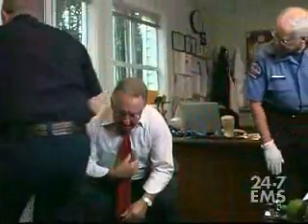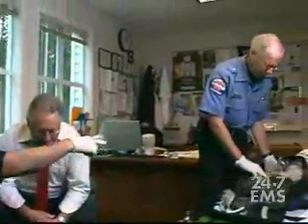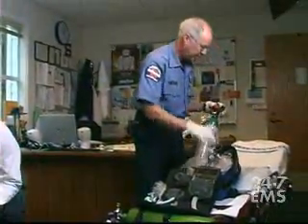Fire department. Hi, sir. What seems to be the problem? Can't breathe. Okay, go ahead. Let's get 15 liters O2, a non-rebreather mask.